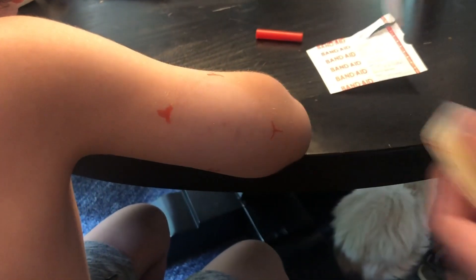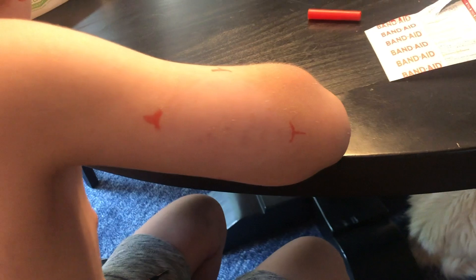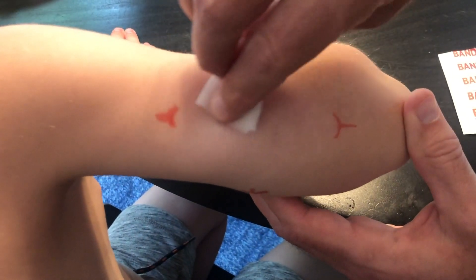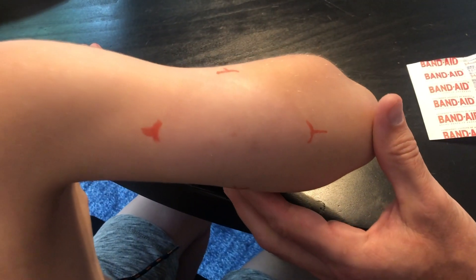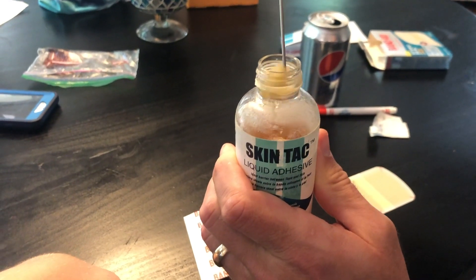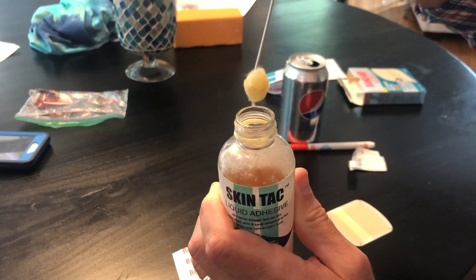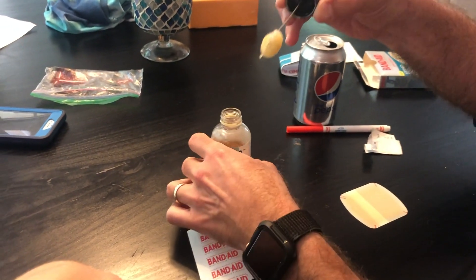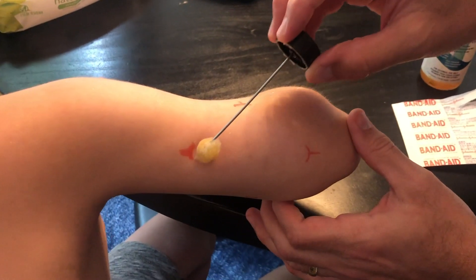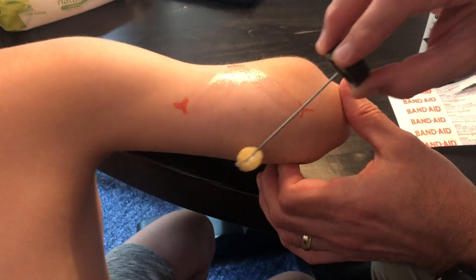Now I can see the shape of where it's going to be, and I'll prep that site with alcohol and SkinTac. First, I wipe off the area with alcohol to make sure it's totally sterile and clean before any leads go in. Then I take the SkinTac — it has a little foam ball applicator — and I squeeze it out so it's not dripping with extra adhesive, because this stuff can get messy. I start along the top and trace the pattern of where that bandage is going to go.